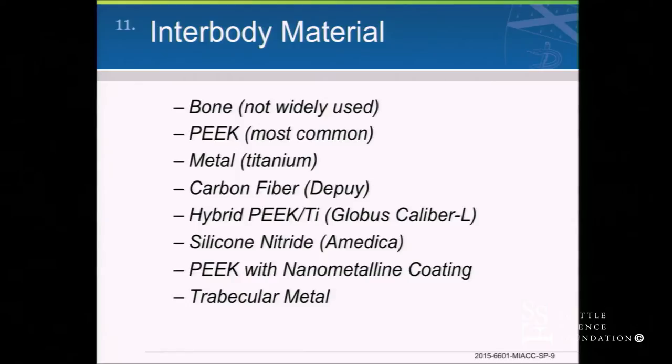And again, it's not fusing; nothing's going to fuse. But you know, it's like putting on a combat boot and lacing it up. And that's kind of what most of the PEEK and this laser etching is. Titanium and this laser-etched PEEK is the same thing. So you're getting the radiolucency, but it has that surface that's etched on with this laser. It's pretty cool stuff. Right.